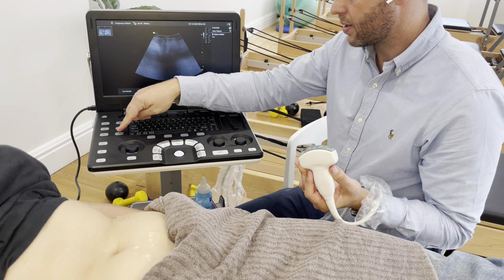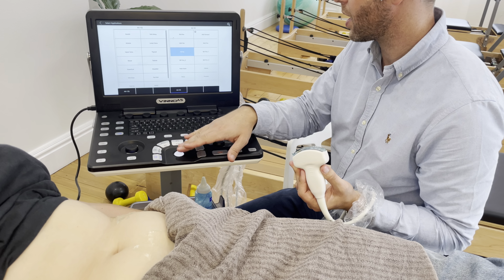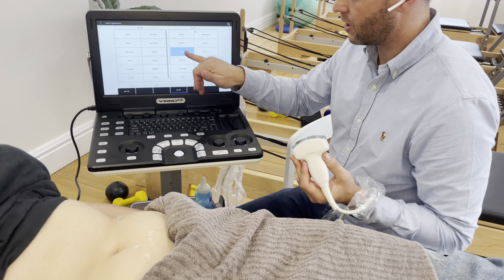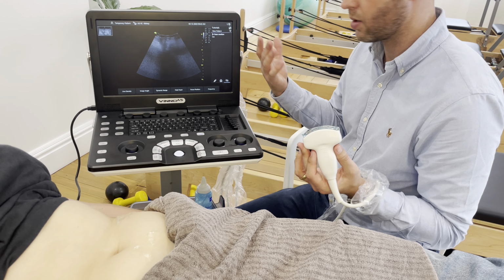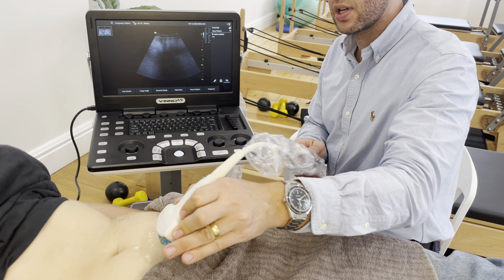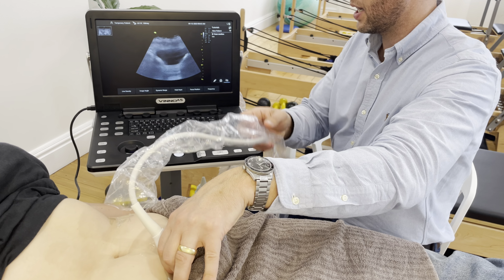And as always, I like to start by pressing the exam or the probe icon so I can choose exactly which exam type. Most of these will get a pretty good picture of the bladder. I'm going to choose kidney. You could easily choose abdominal penetration, for example, if you had a patient that you needed to get a bit deeper with.